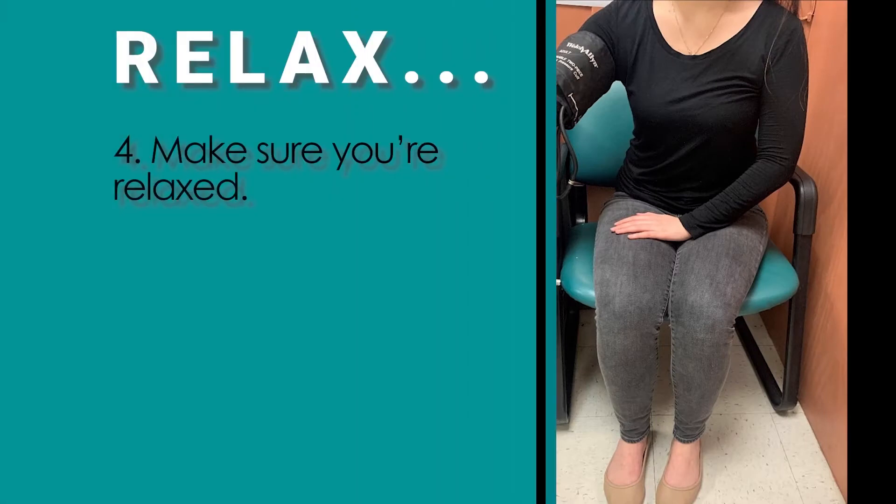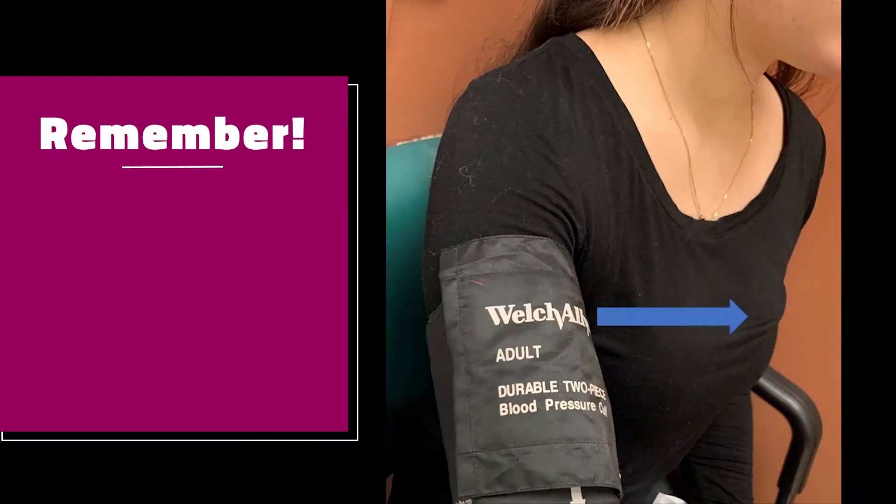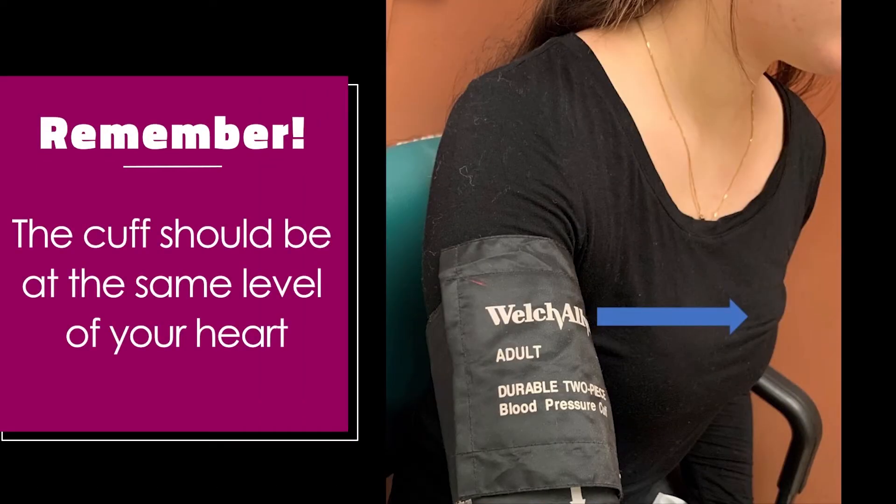Make sure you're relaxed. Sit still in a chair with your feet flat on the floor, and your back straight and supported. Rest your arm on the table with your palm facing upward. Remember, the cuff should be at the same level of your heart.